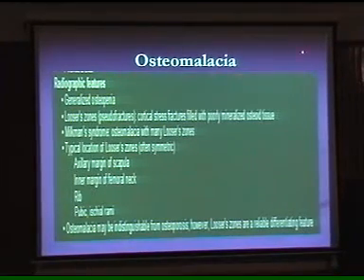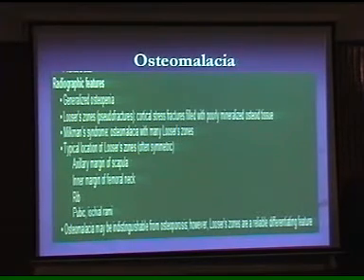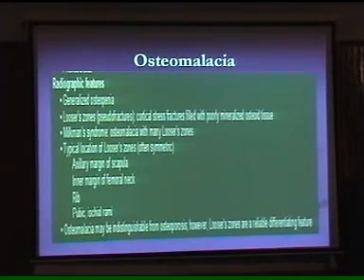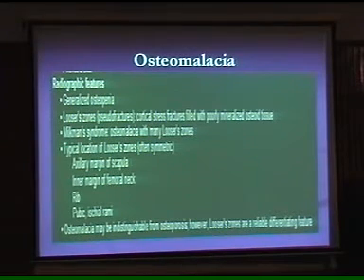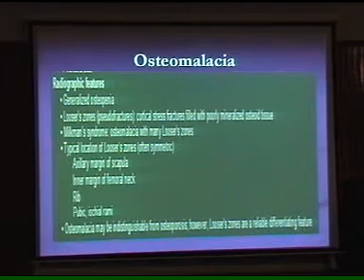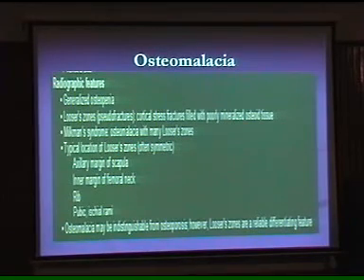Osteomalacia is the same deficiency, but in adult age, in the mature skeleton. And the beauty of diagnosing osteomalacia is that there are certain characteristic areas which you can look for, and they are always bilateral. The predominant areas you can look for are the pubic symphysis, with looser zones, which we call looser lines. They are not true fractures, they are looser zones. Or number two, they may be at the medial end of the upper end of the humerus, the medial end of the upper end of the femora. These are the areas which you can appreciate, or at the level of the sternum.